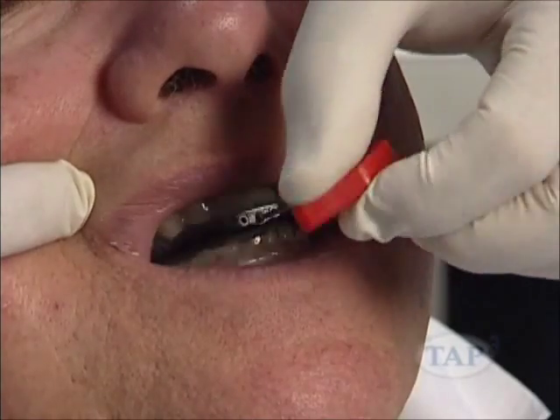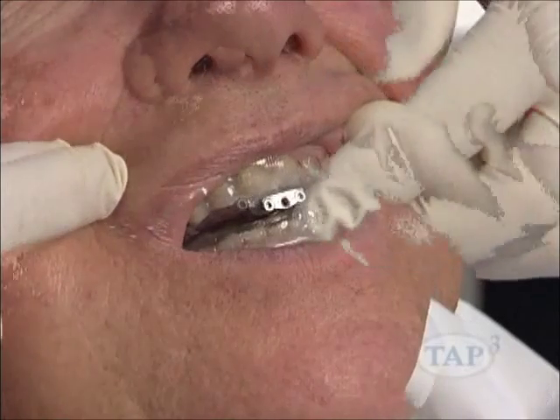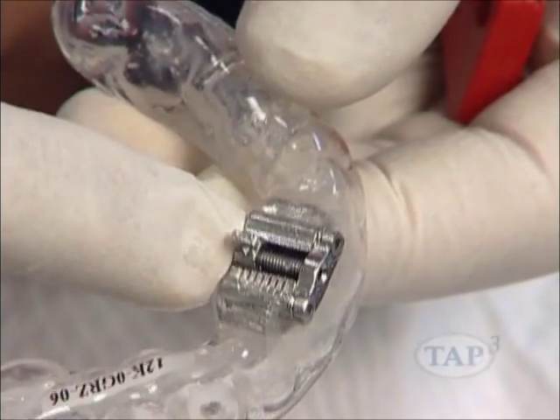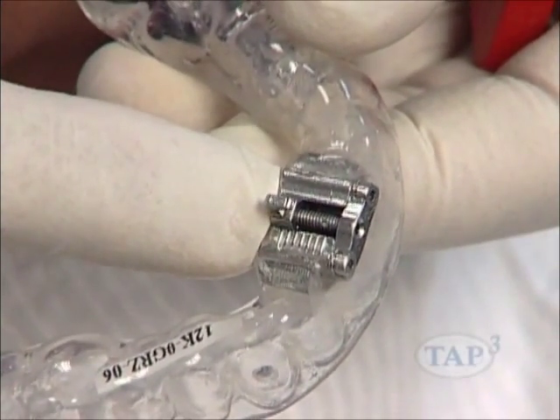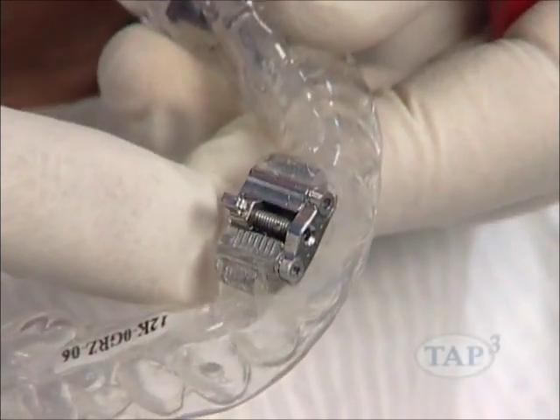From the maximum position, dial the hook back and count the turns. Start the hook in the most retruded or back position. The hook will be all the way back against the posterior of the spindle and base plate.